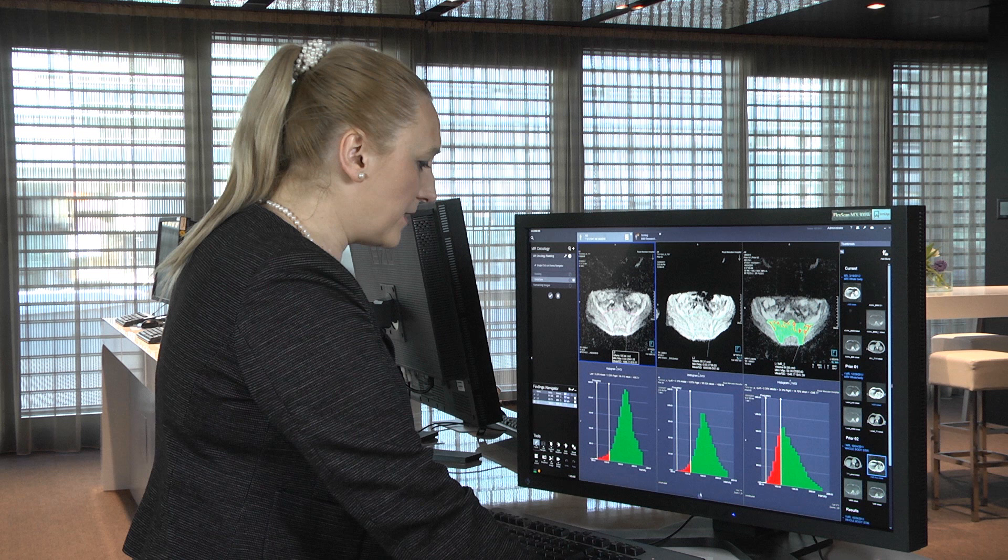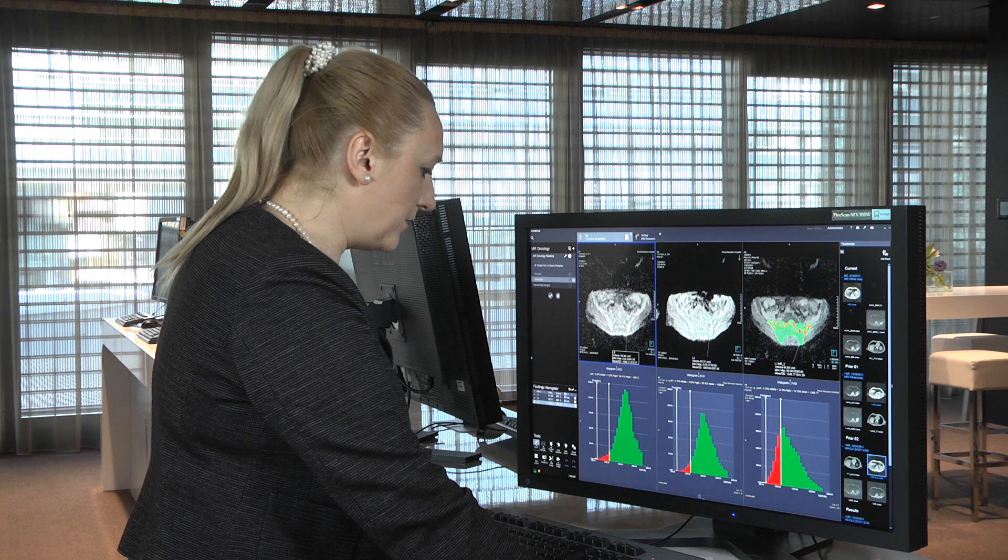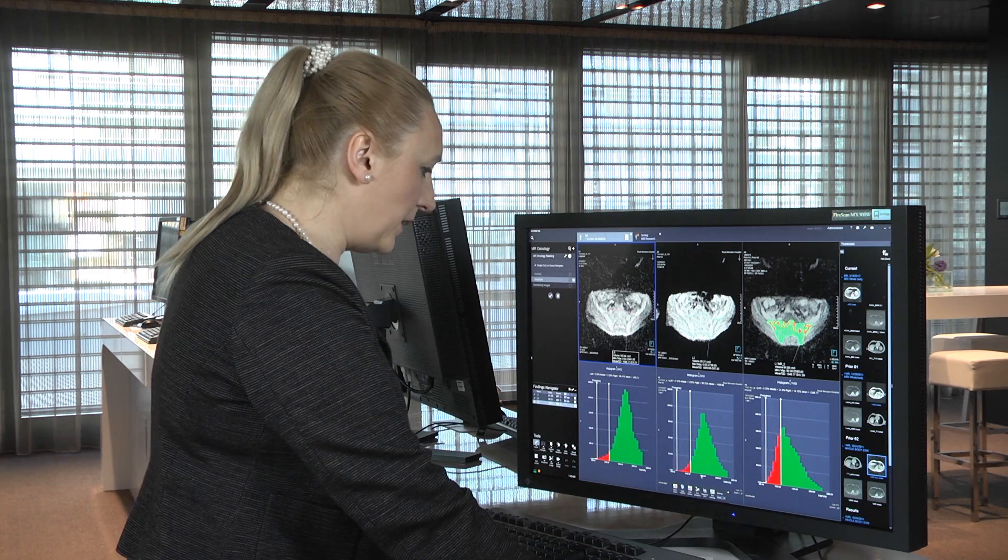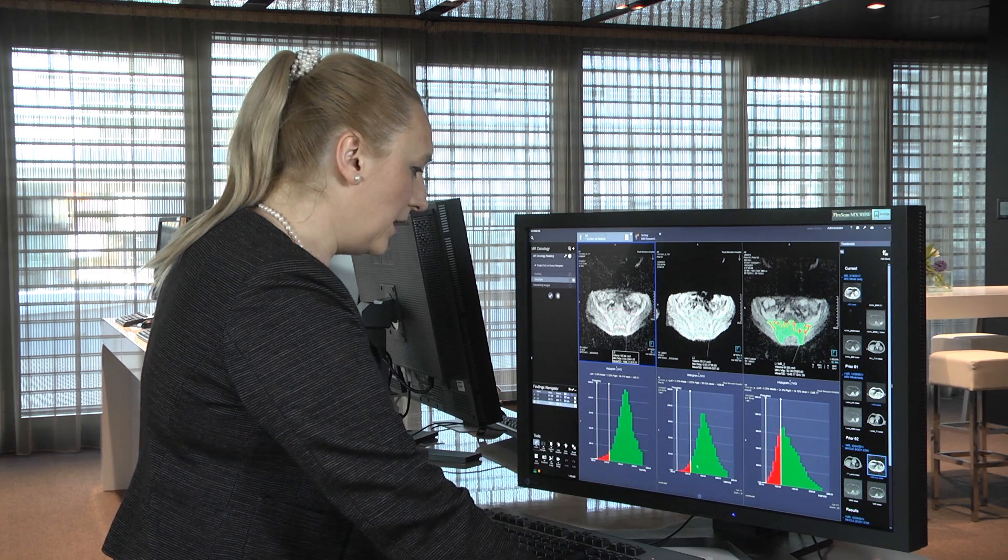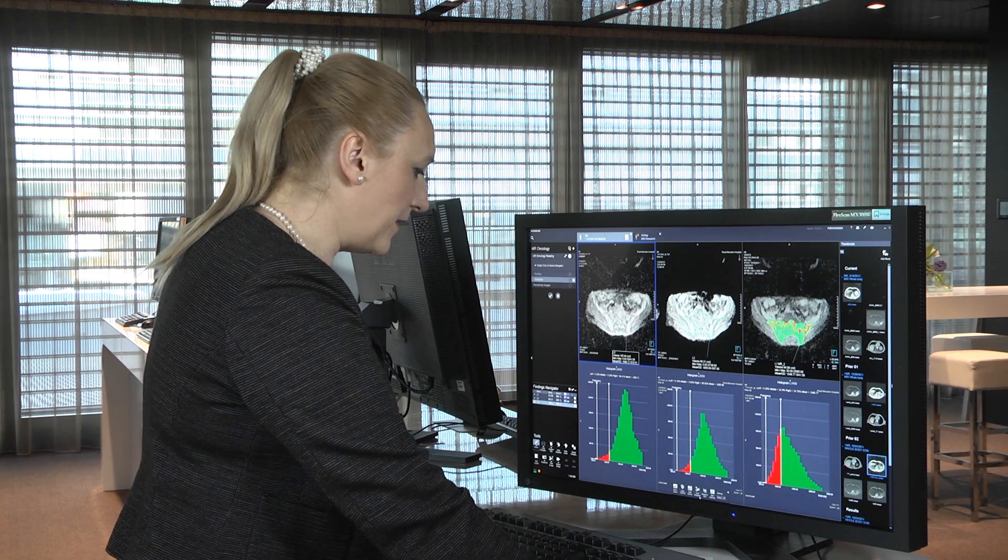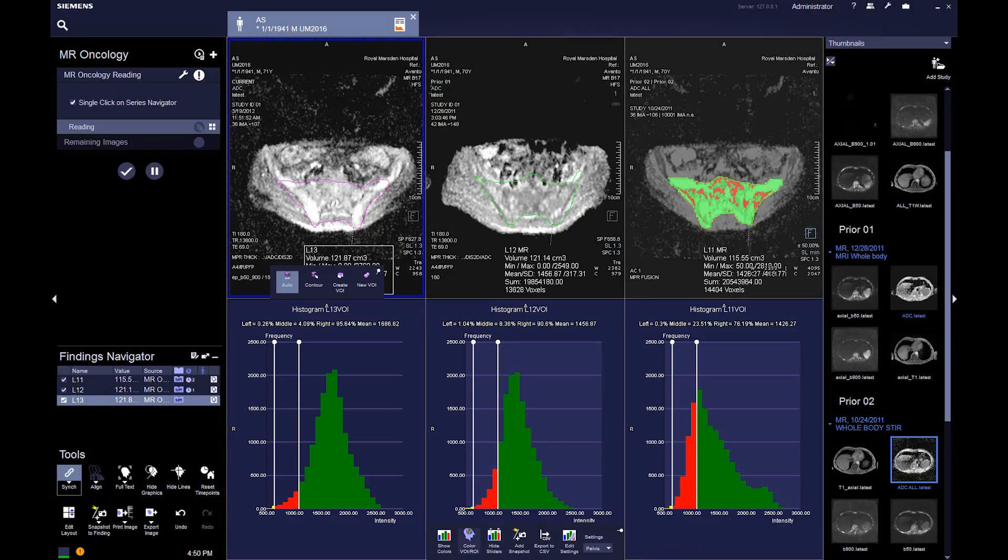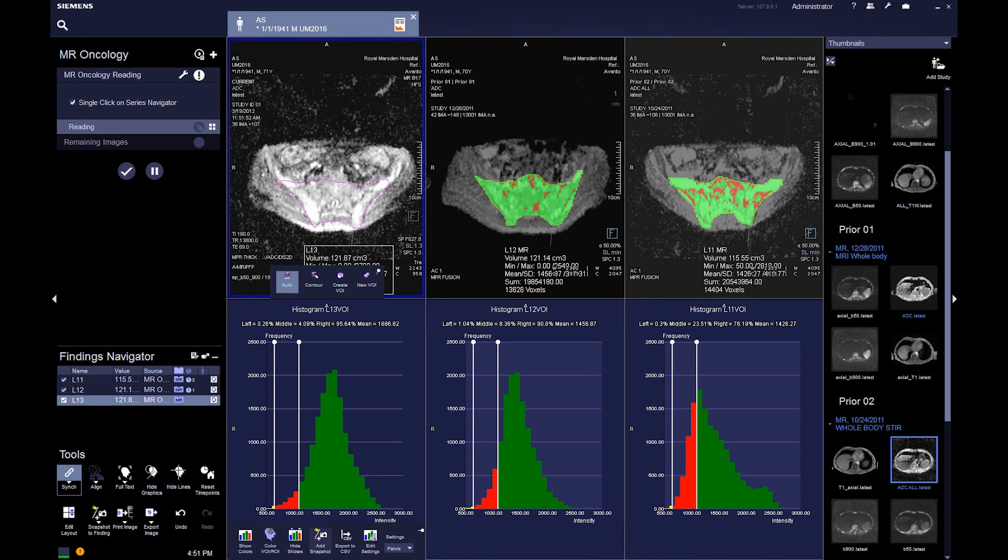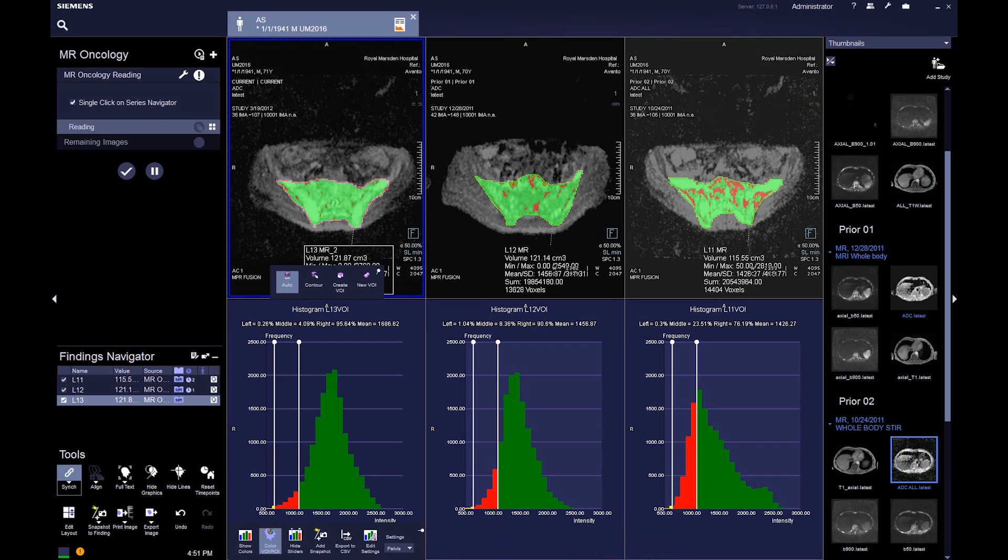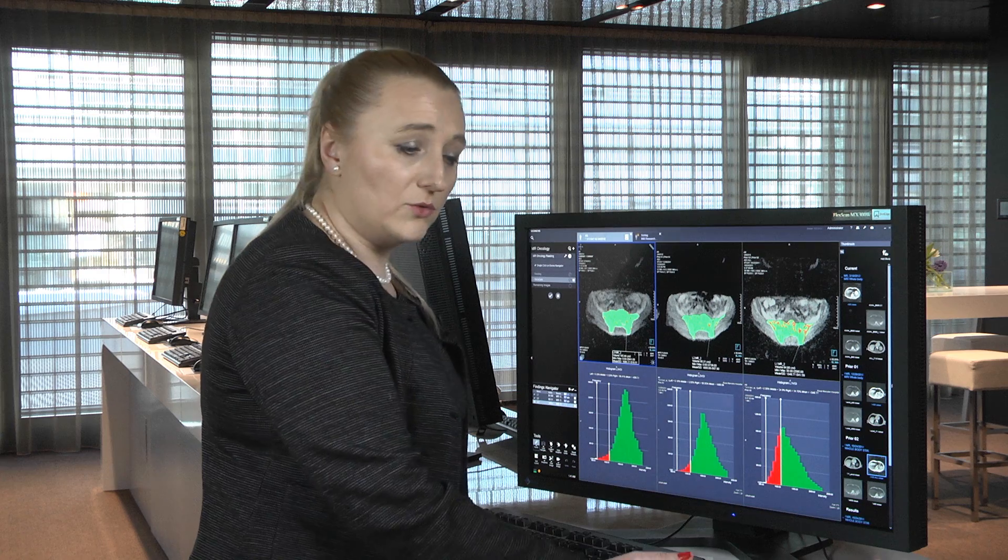Let's see what's happening after the treatment. You may have already seen that the green pixels have increased in size. We have just very few dots in which the tumor remains with an ADC below 1200.